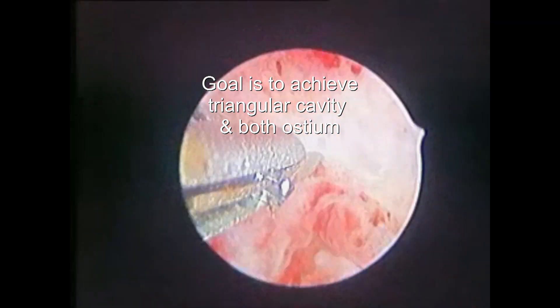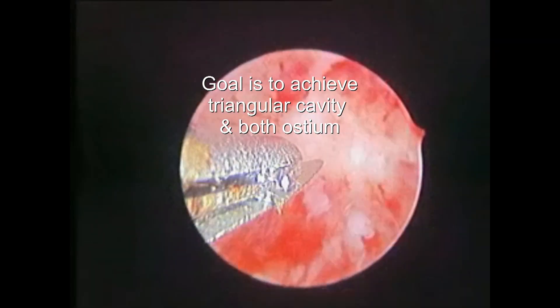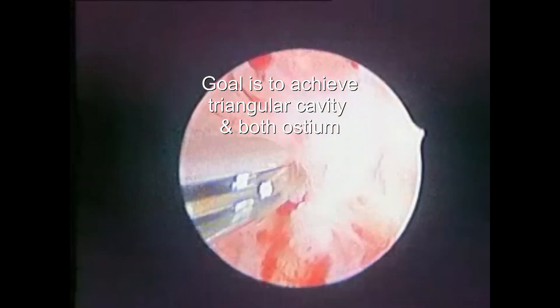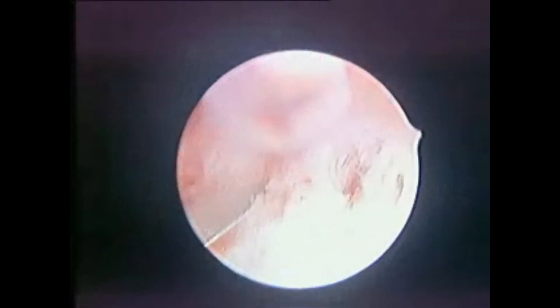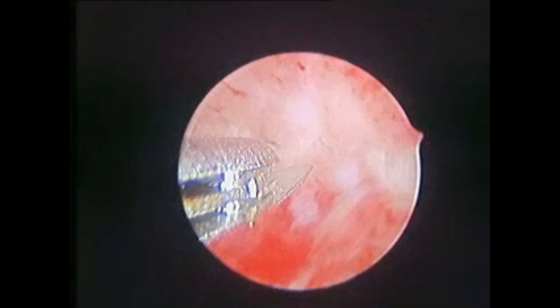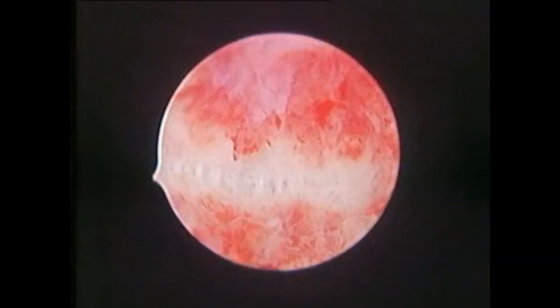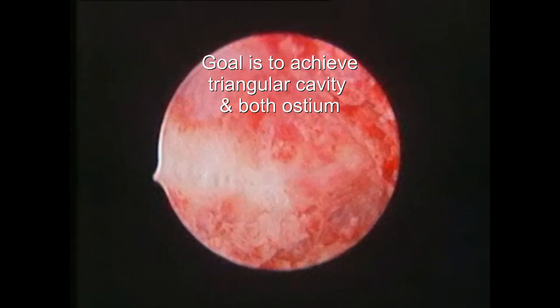Continue doing adhesiolysis in the fundus until you can see both ostia simultaneously, or until you withdraw the scope tip and appreciate the triangular cavity being formed. When you withdraw your scope laterally, you should be able to see the ostia — that is the lateral extent of your adhesiolysis. During fundal adhesiolysis, when you see pink tissue, stop cutting to avoid perforation. You can see the triangular cavity formed — this is how the triangular cavity is restored, and this is how we perform hysteroscopic adhesiolysis.